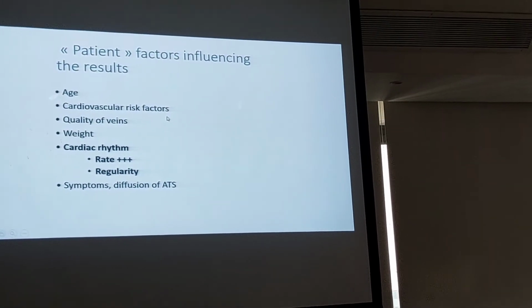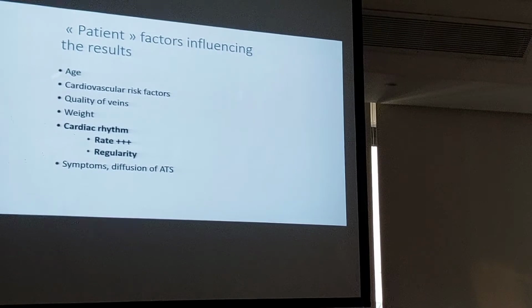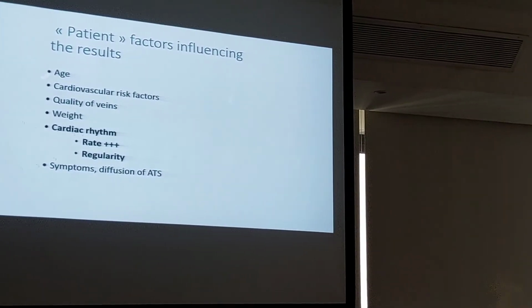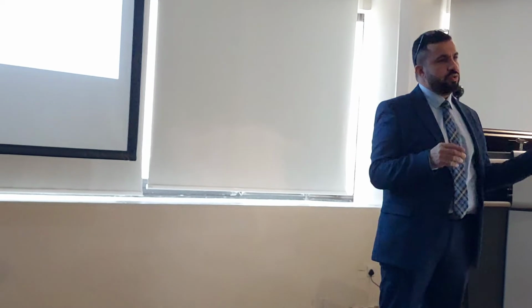The cardiovascular risk factors are actually for the diagnosis point of view, to decide which is the proper patient for cardiac CT scan. And actually, the main justification to request cardiac CT scan from the requesting doctor is for two cases. The first one, the main one, more than 90% of our cases, is the patient that the doctor thinks most probably is a normal patient, in a way that it's not okay to do a diagnostic cath lab for him. So we will go with the cardiac CT scan.